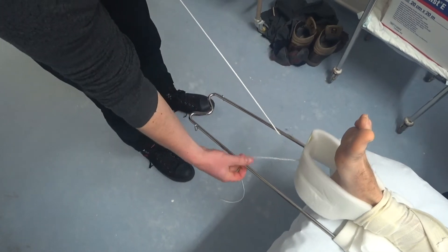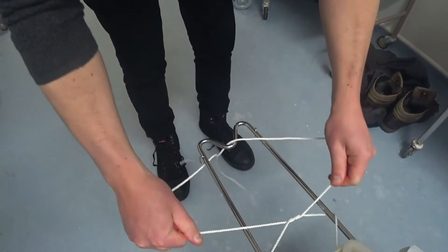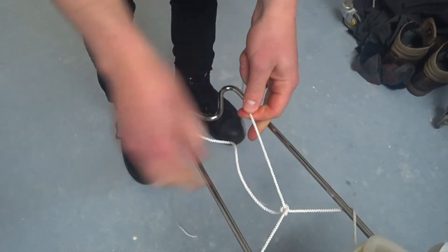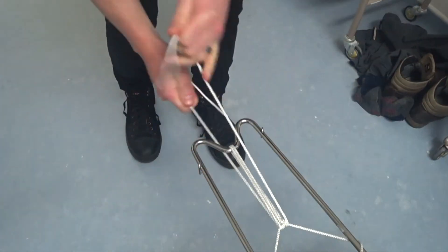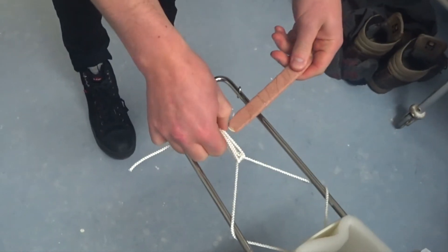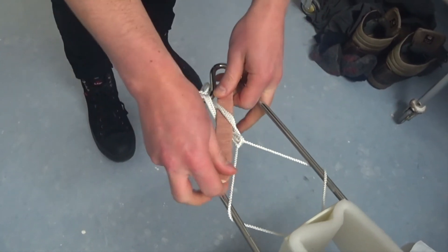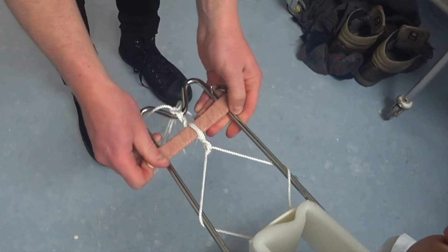We recommend the following method to tension the Thomas splint. Take the strings to the side of the frame, passing one over and one under, securing tightly with a reef knot in the centre. Run the strings down to the base, passing one over and one under, then over the knot and back down to the base. Those strings are then pulled tight and tied off. Finally, take two tongue depressors together and pass through the strings. Twist them until you achieve the desired level of tension. They will then lock against the side of the frame.